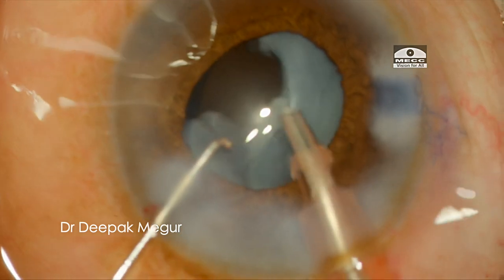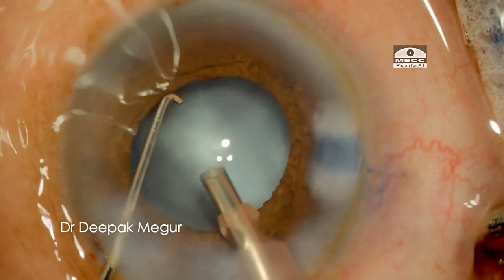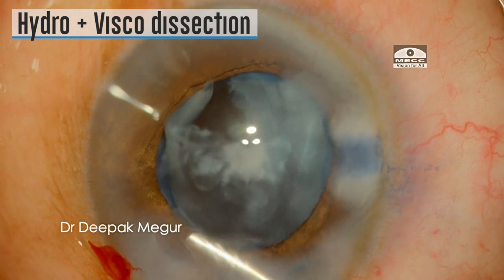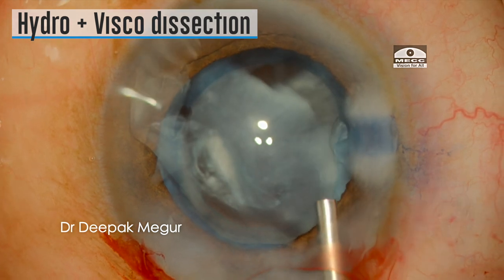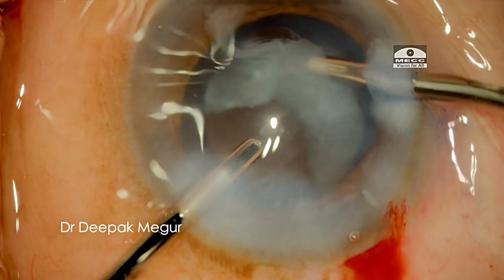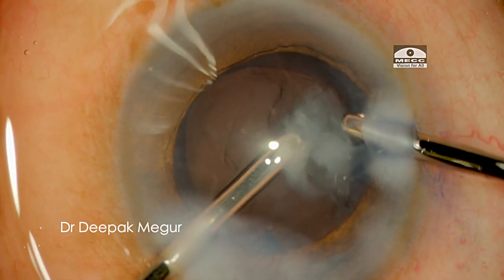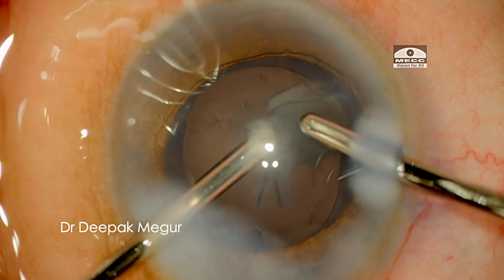After the nucleus, the epinucleus needs to be mobilized out of the bag. It seems to be stuck, so I use a combination of controlled hydro and viscodissection to finally maneuver the epinucleus out of the bag. Once out, it is aspirated quite easily, and finally the cortex is cleaned up.